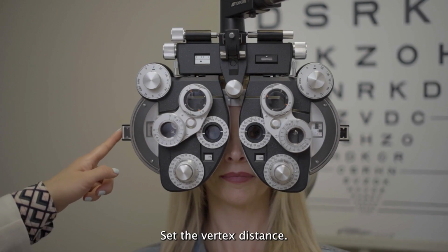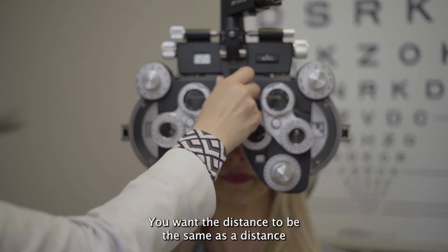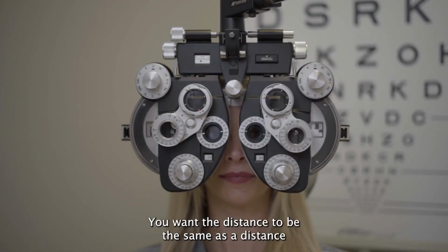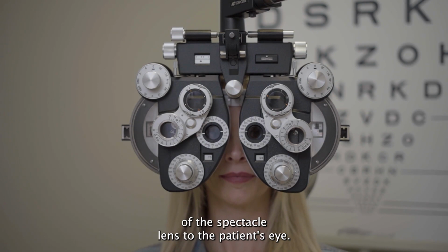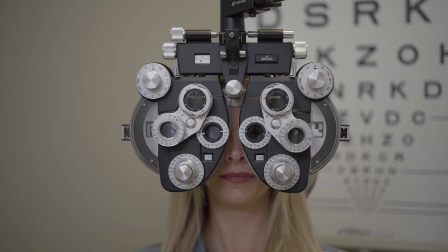Set the vertex distance. This is the distance the lens is from the patient's eye. You want the distance to be the same as the distance of the spectacle lens to the patient's eye. This is especially important for patients with high prescriptions.